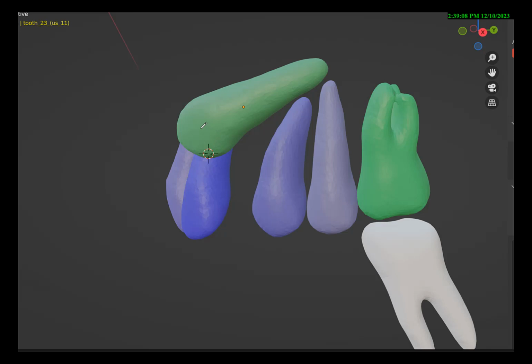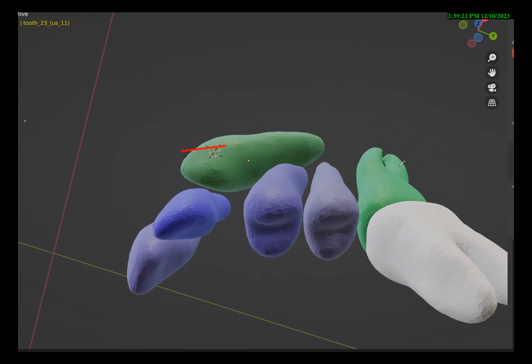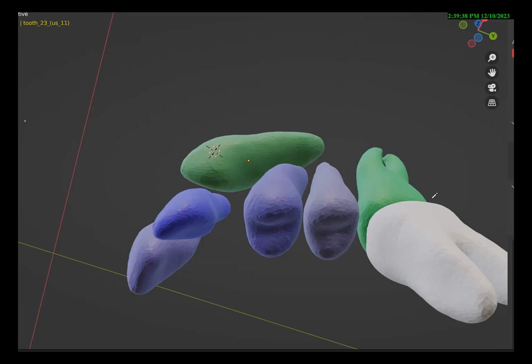Canines, or at least blocked-out canines, appear to be easy to position on the arch, but there are some considerations that need to be taken into account. The first one is pretty obvious: the difference between the axes in the transverse between the canine crown and the molar crown. If you go from the premolar to the canine to the lateral incisor, there are significant differences in transverse positioning.